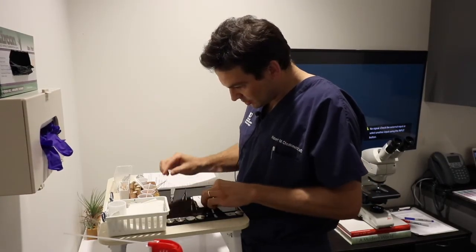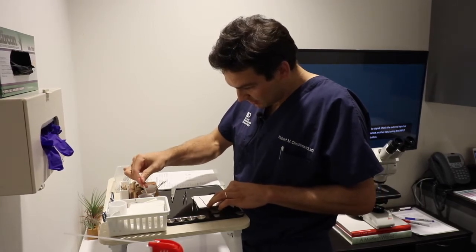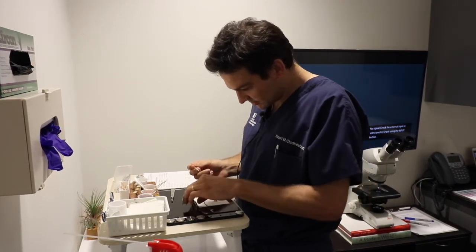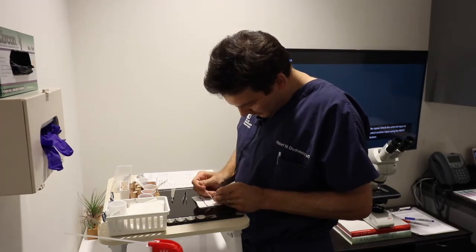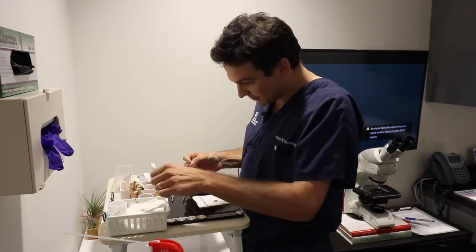So I ink specific areas on the tissue to provide as markers if I need to go back to the patient. Here you see me marking the tissue as a reference guide.